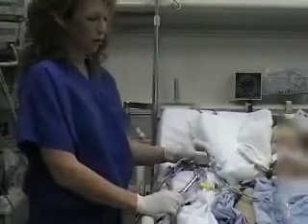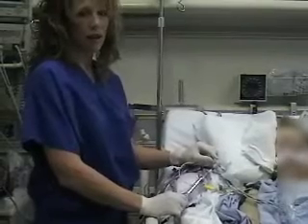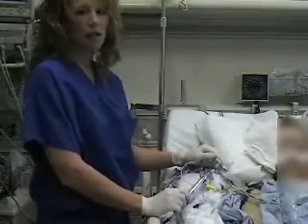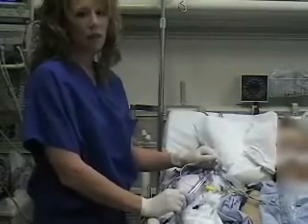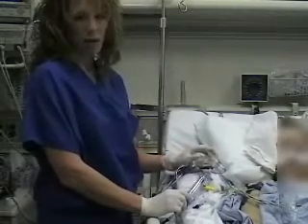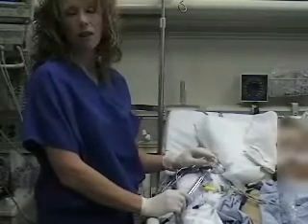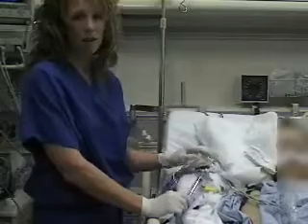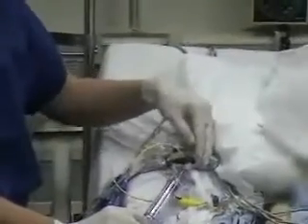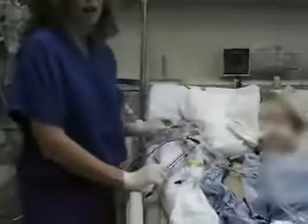You will need to program in the accurate height and weight — the height should be in centimeters — and the appropriate vital signs. You will need to enter this into the monitor using the keypad on the side of the monitor. You will need to let the monitor calculate your hemodynamic profile for you, and at that point you can print that.